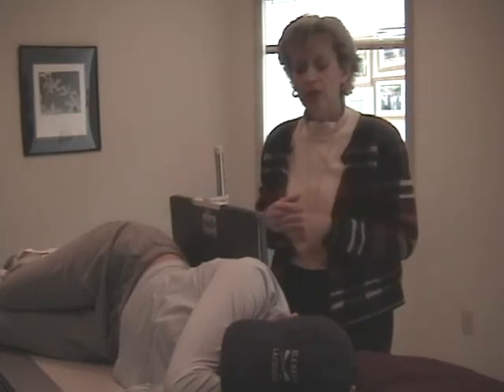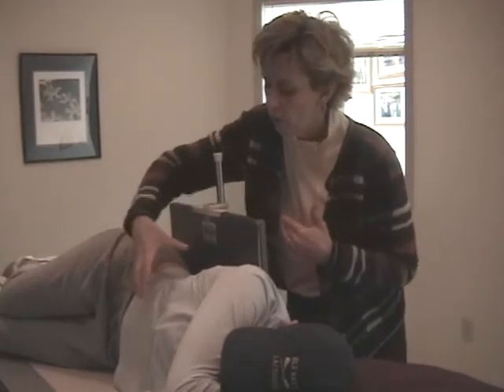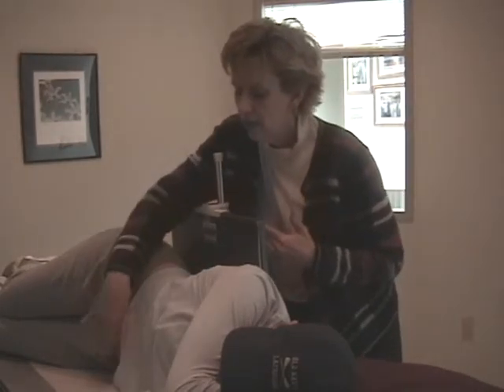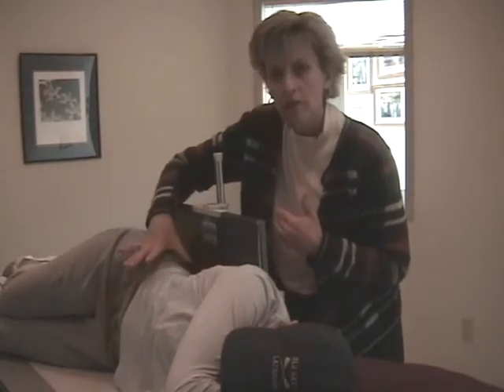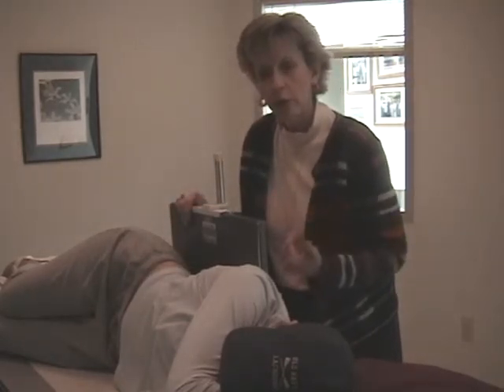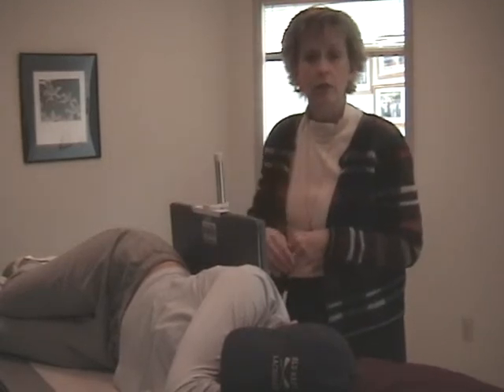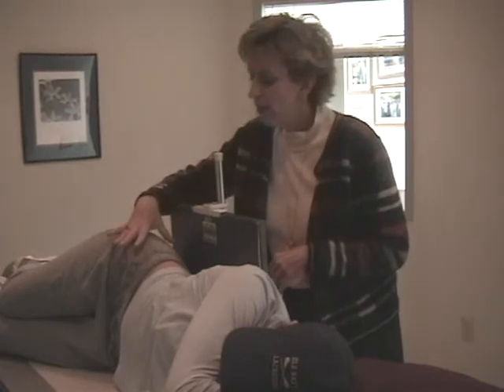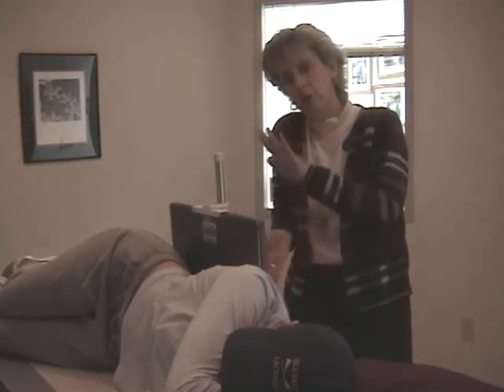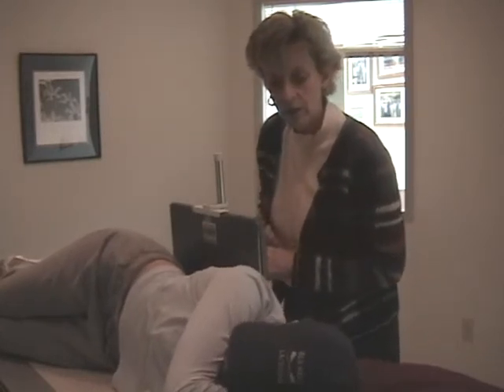When we look at a decubitus film, when you look at the density, again, look at more of the right side. This side may tend to be darker, that side may tend to be lighter. This is the important side because you're looking for air to rise. And if she's in a true lateral position, the spinous process of the vertebrae will be in the center of the vertebral body, and the wings of the ilium, again, will be symmetrical, and they will look even on both sides. And Drea, do you have anything to recommend?